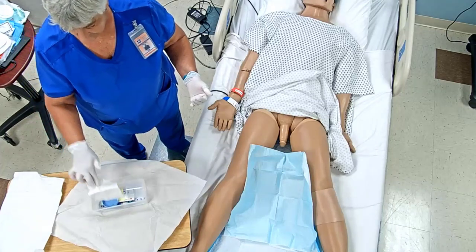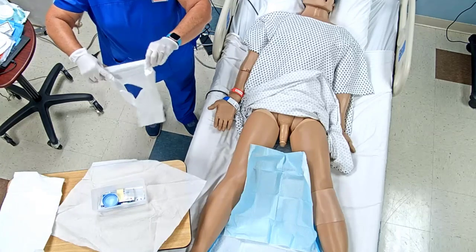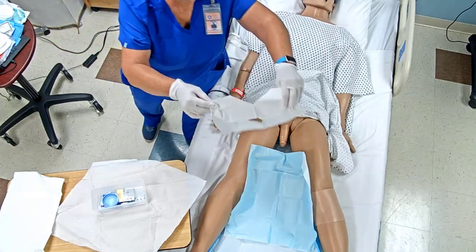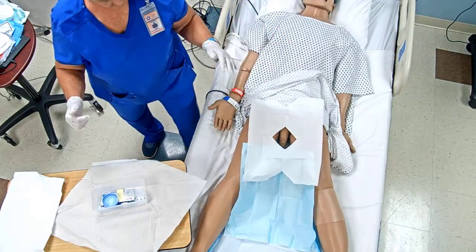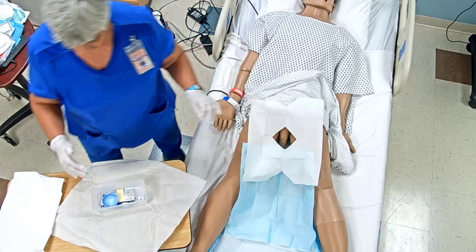Again, I'm going to go ahead and get my fenestrated drape. Some people don't use the fenestrated drape, but I'm going to show you how to use the fenestrated drape. Okay, making sure it's not touching anything. We're going to come over and we're just going to lay that on top. So don't worry about it right now. I'll fix it whenever I get ready to start my procedure.